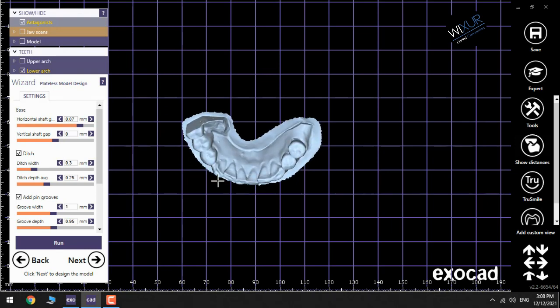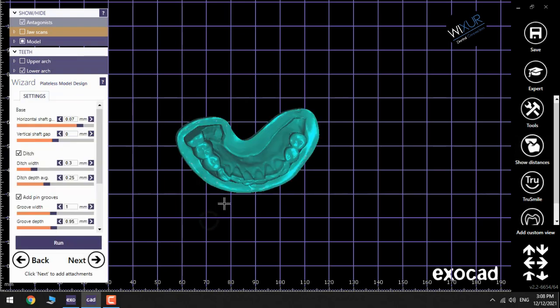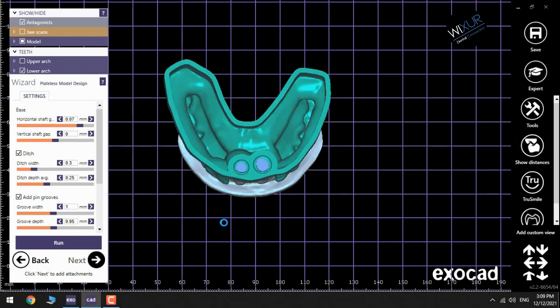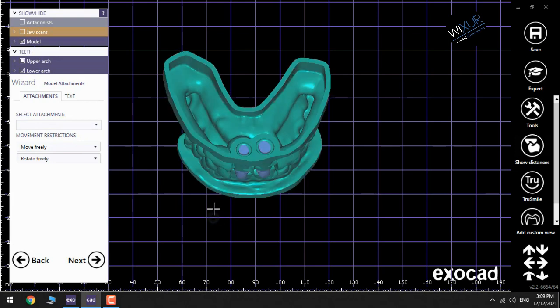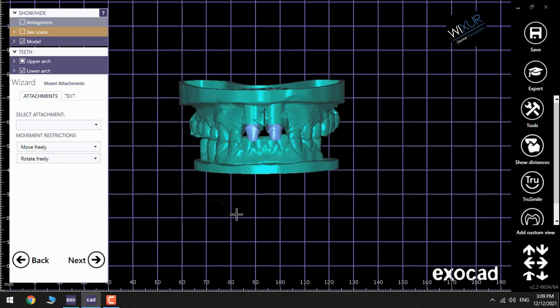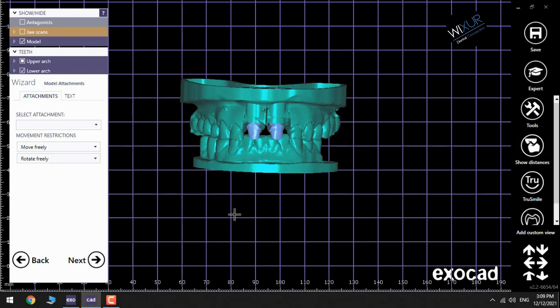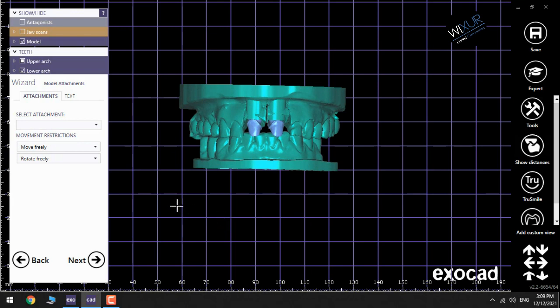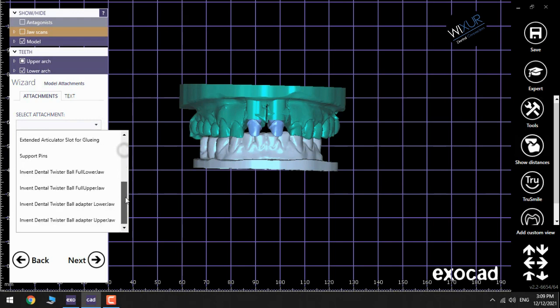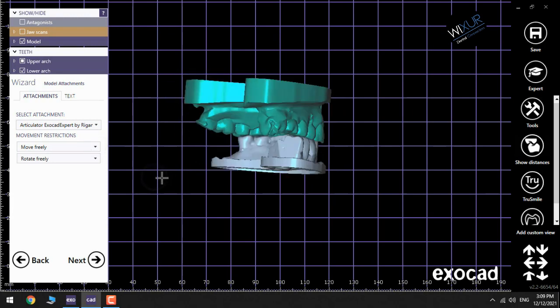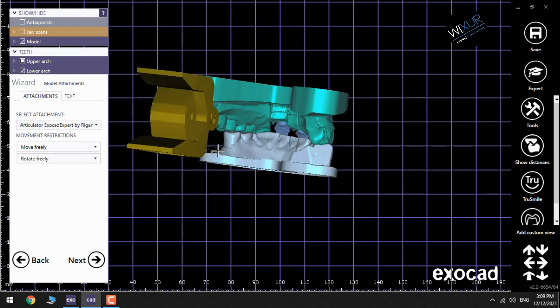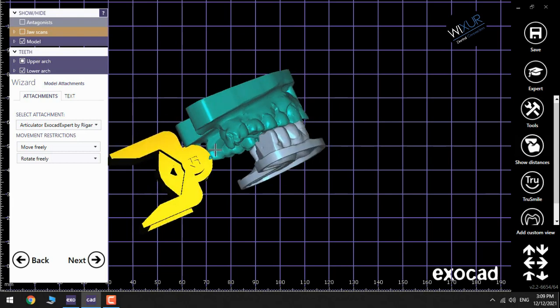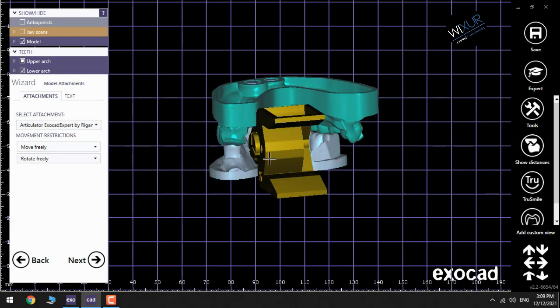And then click Run. This is my lower jaw and the upper jaw. In this part you can add an articulator if you need it by choosing the attachment in the wizard window on the left. Choose one of them, for example the first one, and click on any parts of the models. Now rotate it for the proper position.